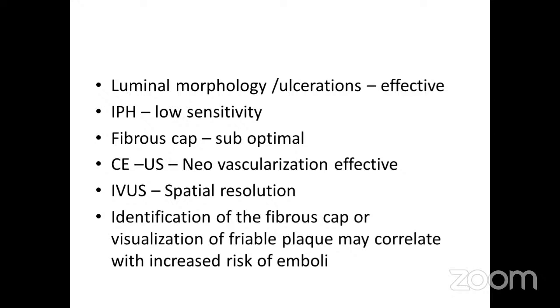Coming to the invasive one, intravascular ultrasound gives a high spatial resolution. It helps in identification or visualization of the fibrous cap, which may correlate with an increased risk of emboli.